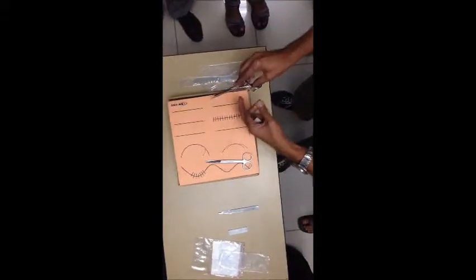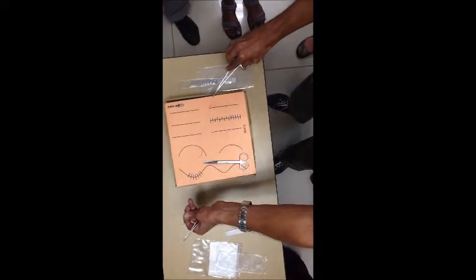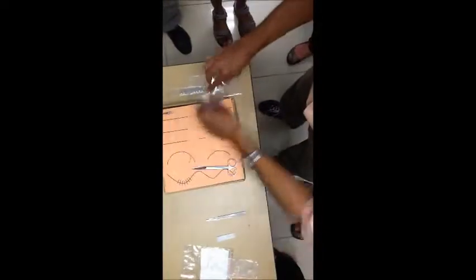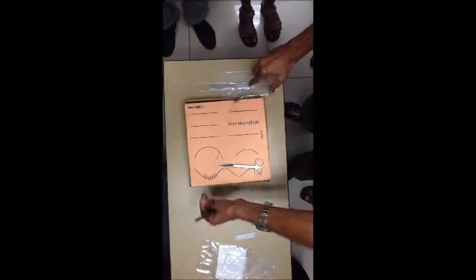Take double throws. Put the first knot. See how quickly silk tends to slip. Silk is notorious for slipping. Nylon, all these things. Make sure we have taken multiple throws so that it is firmly embedded.